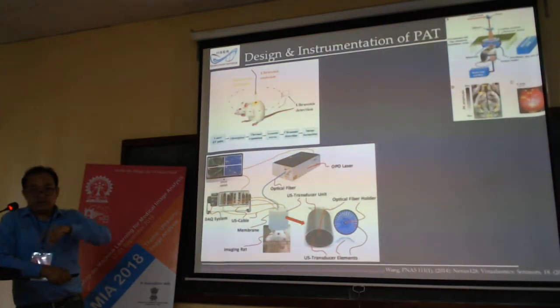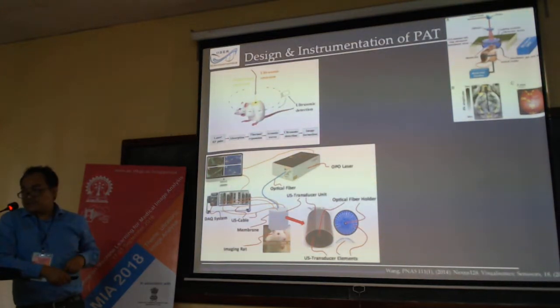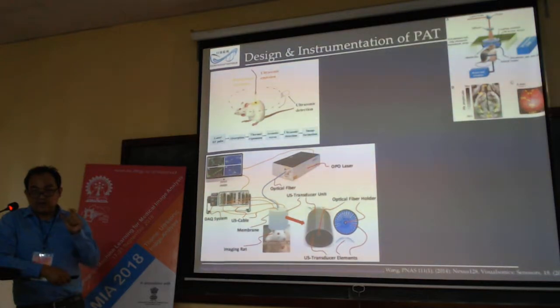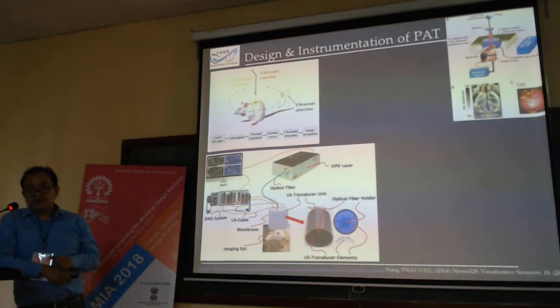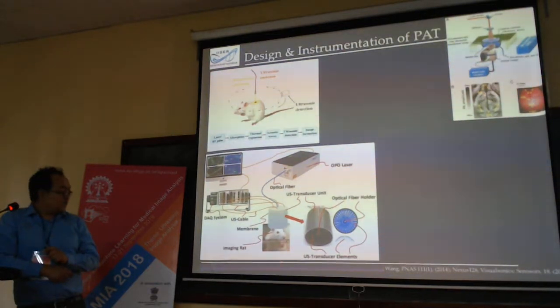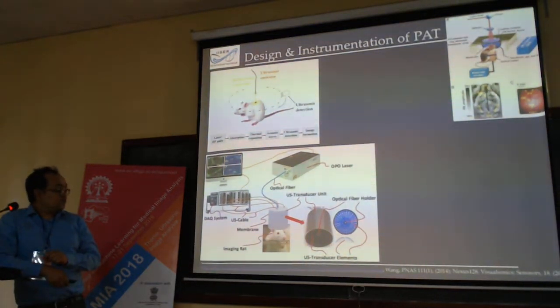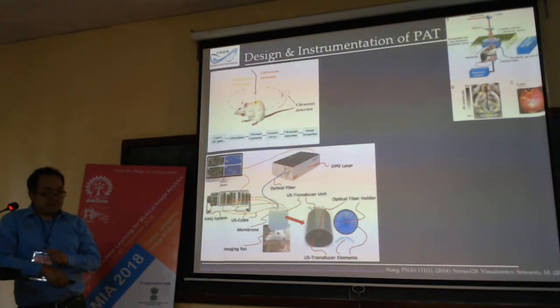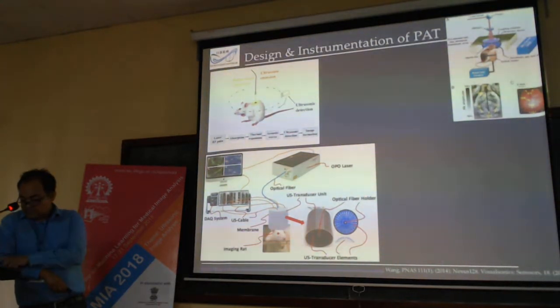So we can use the previous delay and sum or beamforming algorithm, other than the solution of differential equations. This kind of technique is reported to be very successful for imaging.